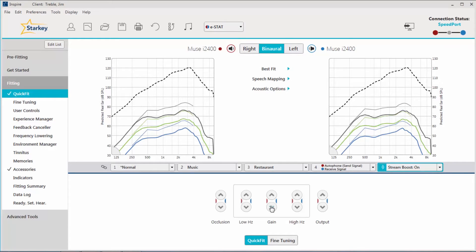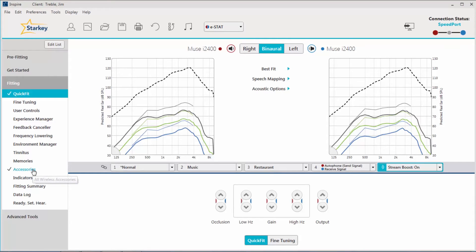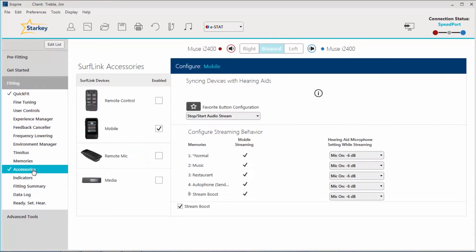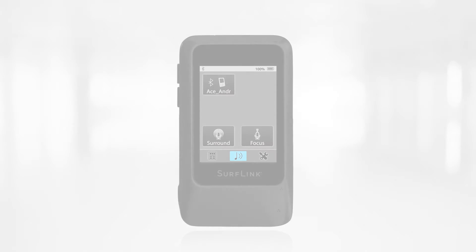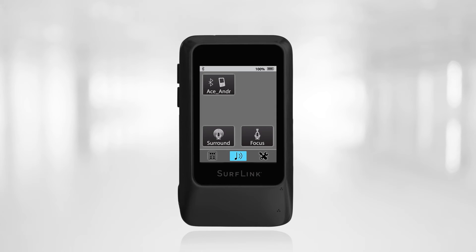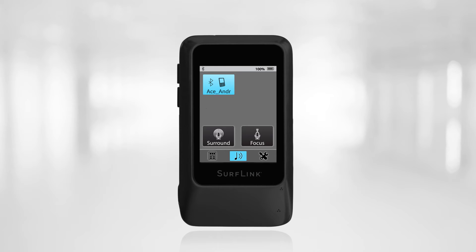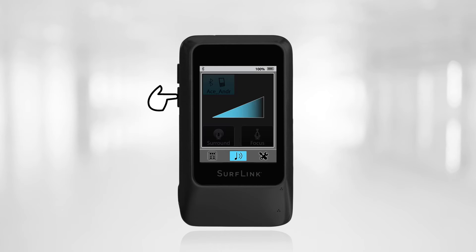Another option would be to disable the StreamBoost memory completely and stream using the other programmed memories. To do this, navigate to the Accessories screen within Inspire 10, then uncheck StreamBoost. Now, SurfLink Mobile 2 will stream in whichever memory the patient is currently using when the streamed signal begins. Another simple solution would be to reduce the volume of the streamed input from the streaming screen on the SurfLink Mobile 2 itself.